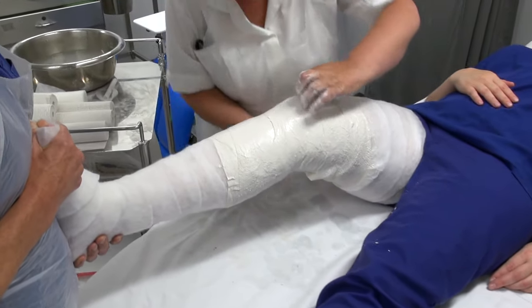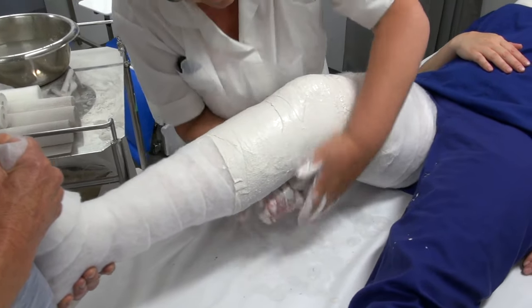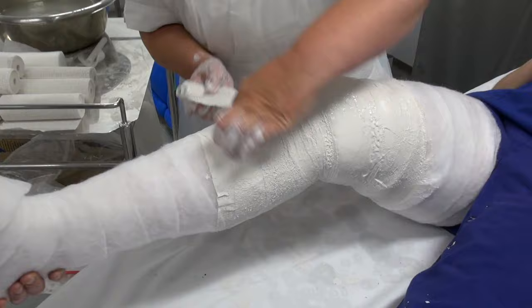Now she's putting her second layer on so the fracture site will be nice and secure, then she'll continue plastering the rest of the leg.